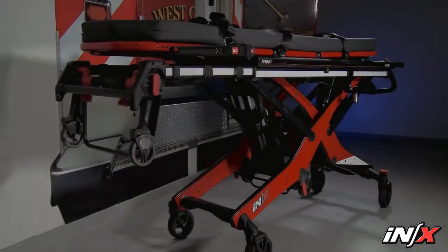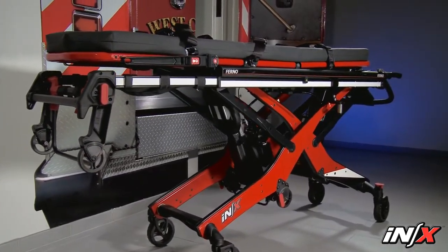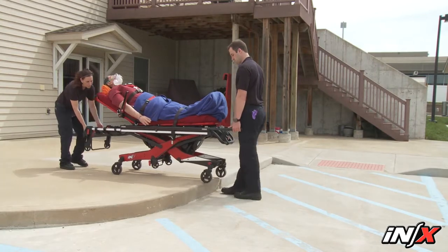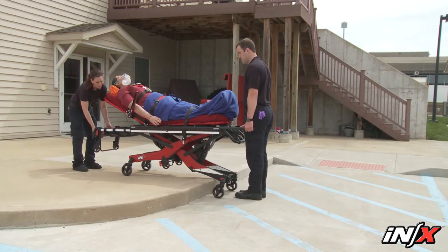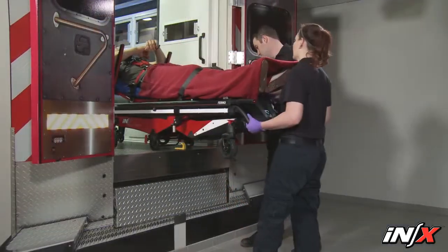The NX integrated patient transport and loading system is an emergency patient handling system designed to transport a patient over various terrain and to be loaded into and unloaded from an ambulance for ground-based transportation.